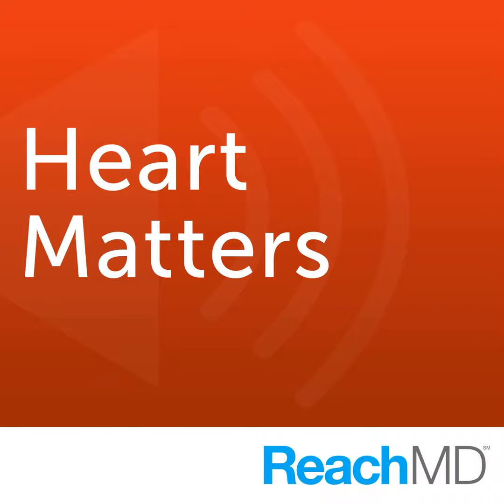I am not an expert in terms of the imaging technical features, but what I am told is that the way you do the test for each one of those vascular beds is slightly different in terms of the way you inject the dye, when you take the pictures, and what area you scan. So although in theory it sounds good, like you get buy one, get two free, if you're looking at the coronaries, you can get the pulmonary arteries and the aorta at the same time.